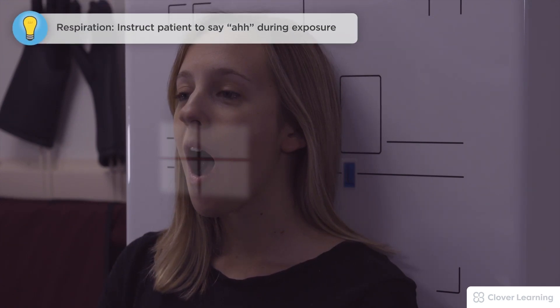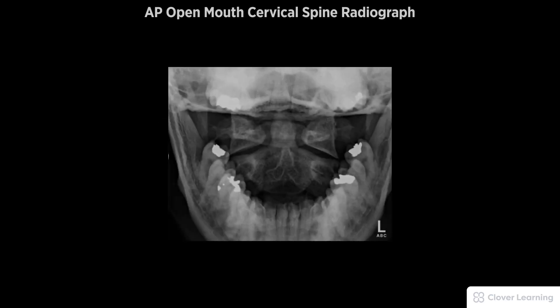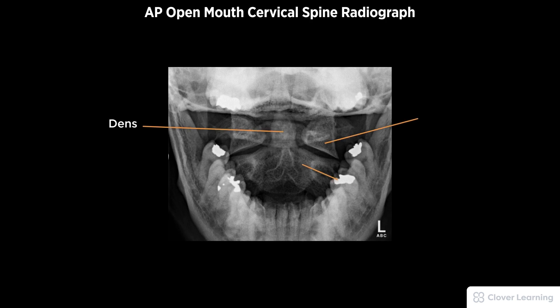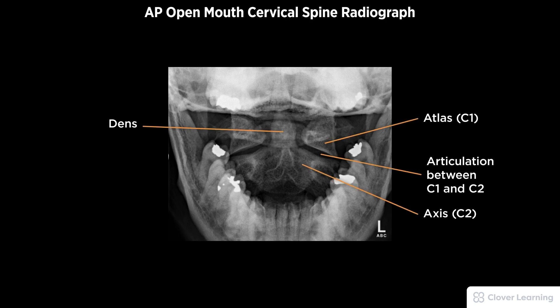As I step away from the patient, I instruct her to say 'ah,' which depresses the tongue to the floor of the mouth, and then the exposure is taken. A diagnostic AP open mouth cervical spine radiograph must be free of motion and rotation. Demonstrated anatomy includes the dens, atlas, axis, and articulations between the first and second cervical vertebrae with proper visualization of soft tissue and bony detail.